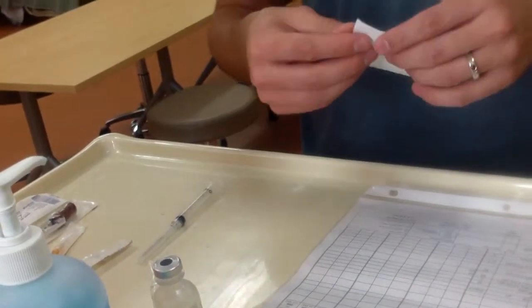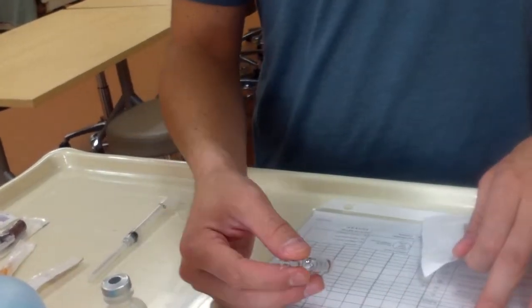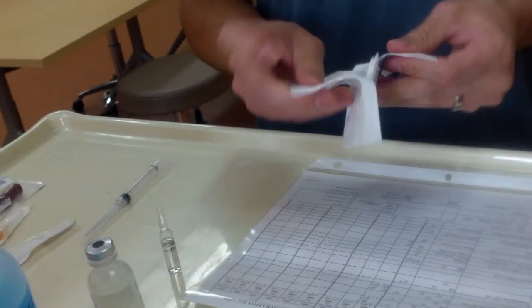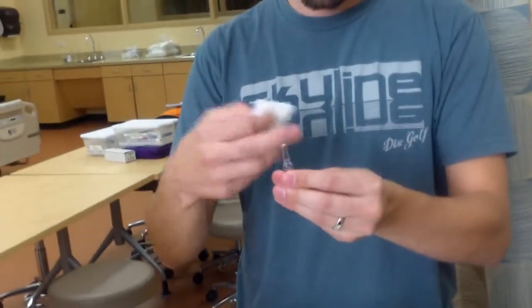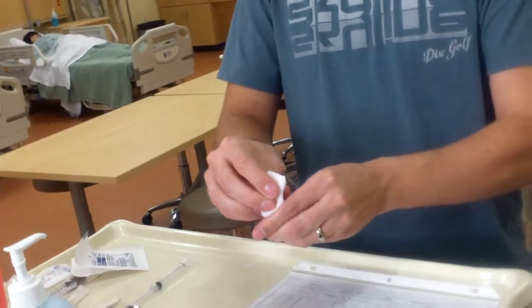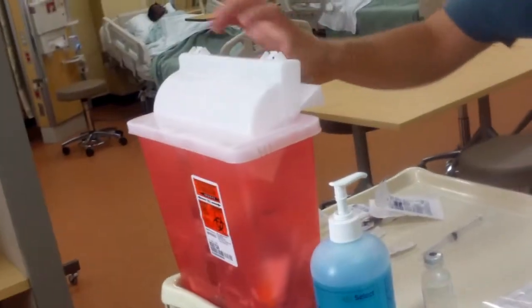So then I need to open my ampule. This is part of my second check. I'm making sure that I have the right medication, the right time, route, dose, and medication once again, along with the second check. I need to open the ampule, make sure all the fluid's down in the base, and then wrap a little piece of gauze on it, and then you just give it a little crack, opening this away from me. Crack that open. That goes in the sharps container.